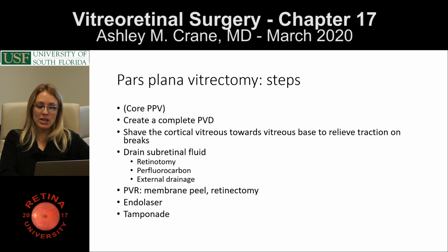In PVR, sometimes you do a membrane peel or a retinectomy, and then after you've drained the subretinal fluid, that's basically a fluid-air exchange, so you're under air now, and your retina's flat, you can laser, and then you tamponade.